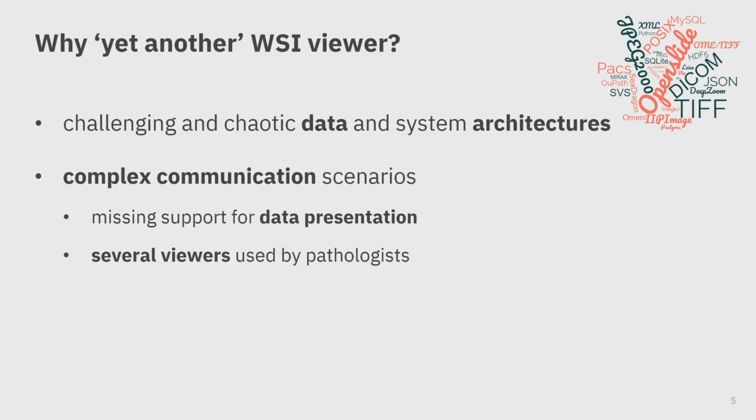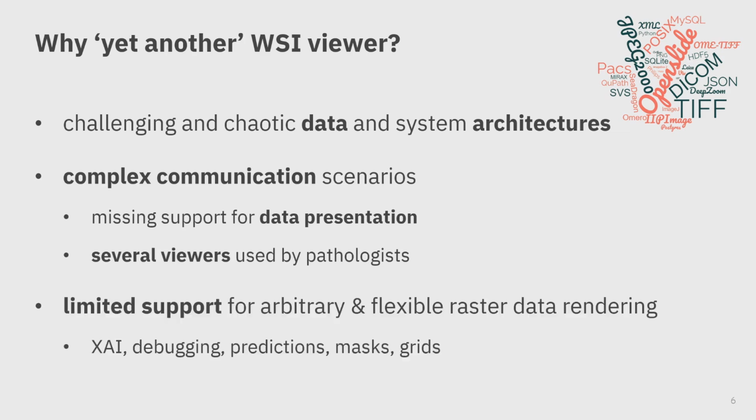We wanted to have a platform supporting routine work of pathologists as well as researchers, so that it is easier for them to either share findings and communicate, or push forward analysis research to the clinical practice in the long run. AI can generate many raster data we needed to effectively visualize in arbitrary overlays. Most viewers are able to, if anything, render data from multiple image channels and limit visualization capabilities. We needed a platform able to visualize an arbitrary amount of pyramidal files with the ability to easily create new visualizations or combine existing ones in new ways.